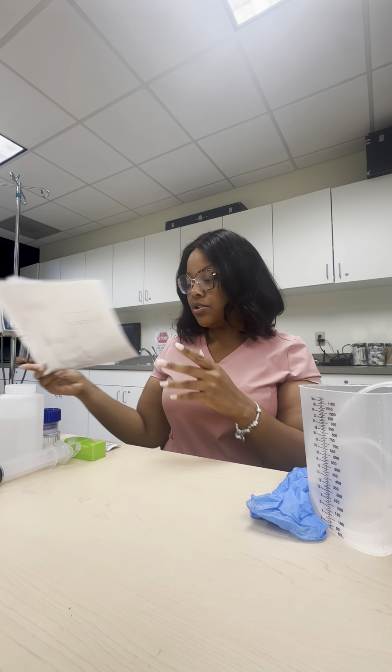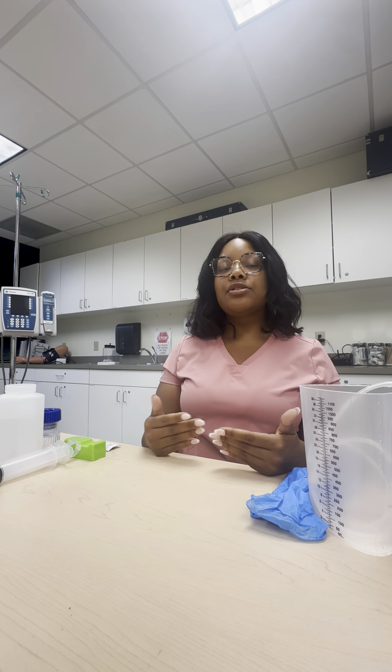So when I went to the MAR, I verified my medications while I was pulling the medications. Once I got the medications, I did my checks, and then now before I give the medication, I'm going to do my check. So we want to go into the patient's room. We want to introduce ourselves to the patient. Hi, I'm Asia. I'm going to be your nurse today. The doctor has ordered some morning medications for you. They're going to be going through your PEG tube, and I'm going to explain to you each medication. But if you have any questions, just let me know.